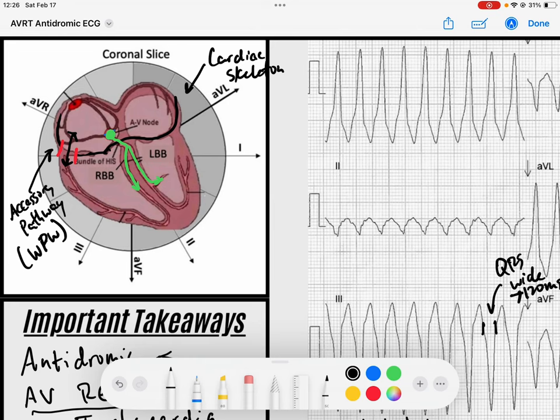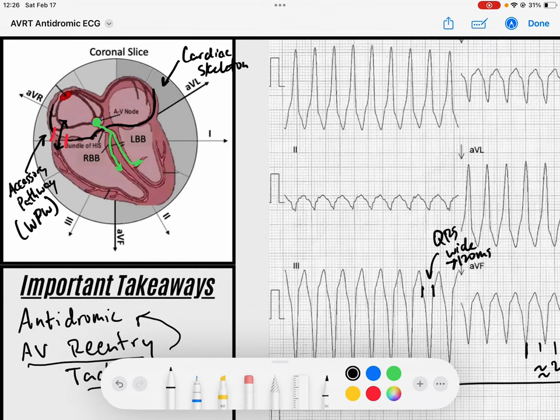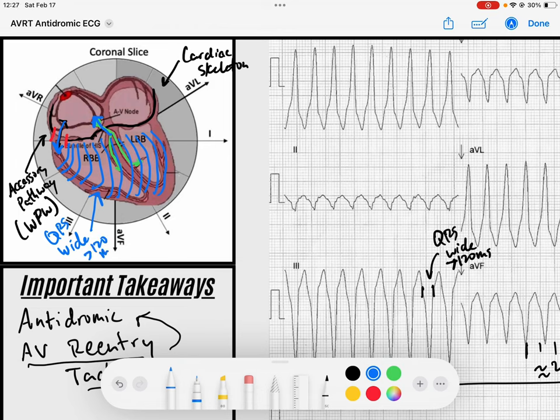So what can happen is these people can have antidromic conduction, which means antidromic means in the opposite direction of the AV node. So it can actually have conduction that goes, I'll draw it in blue, up the AV node. These folks can have a vicious cycle where they have essentially what will initially occur - there will be some type of anterograde conduction through the accessory pathway. And then ventricular depolarization will ensue. A wave of depolarization will occur throughout the entirety of the myocardium. Notice it's not taking that His-Purkinje system that allows for rapid depolarization, and that is why my QRS complex is wide, greater than 120 milliseconds, because it's not taking the normal highway system. It's taking cell-to-cell gap junctions.